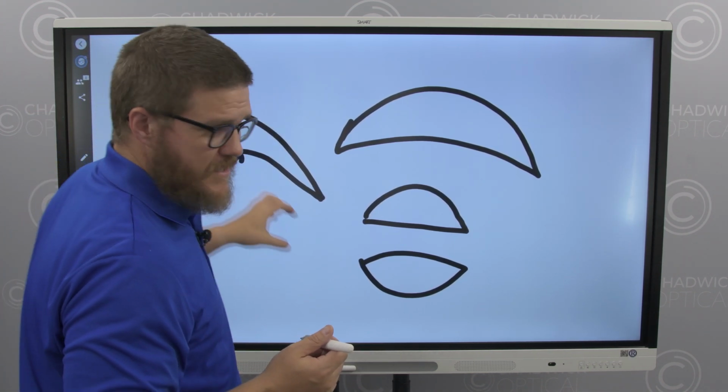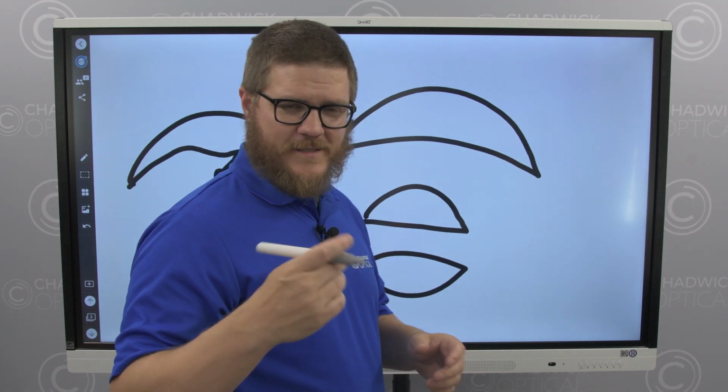So we can make very aesthetic lenses that will look good in the lensometer, but the patient can't really use them. And I think that it's one of the unspoken rules of eyeglasses that eyeglasses should be usable by the patient.